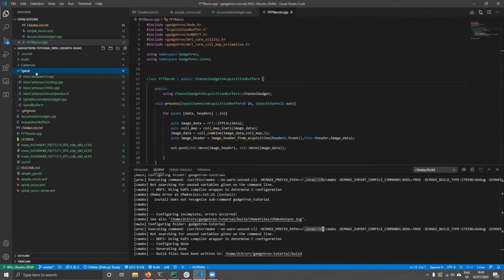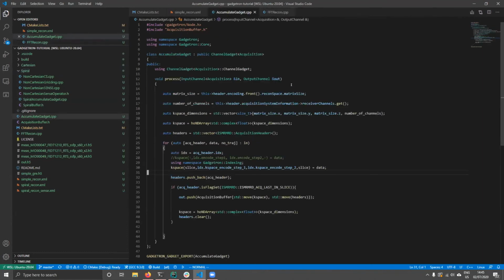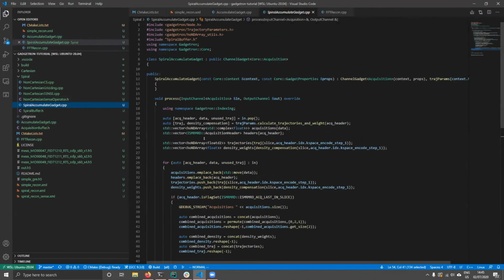Okay, so now we're gonna go on to non-Cartesian. Non-Cartesian is a mess. Cartesian data fits nicely in a nice Cartesian K-space. It's easy to deal with. Non-Cartesian data, they just get K-space from all over the place. So we need to deal with that. That means the accumulate gadget we just made wouldn't actually work, because this K-space doesn't fit, say, a spiral. At least it doesn't fit it very efficiently. So I made a spiral accumulate gadget.